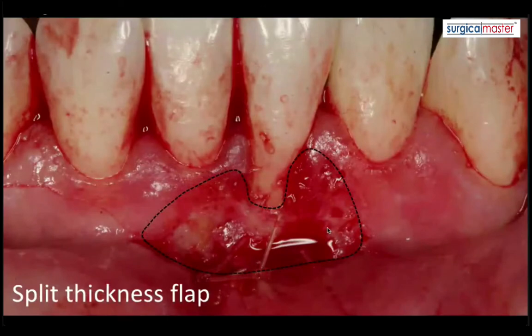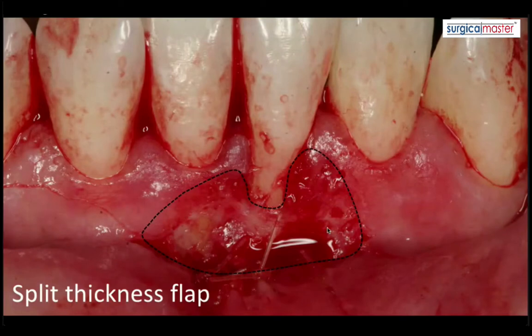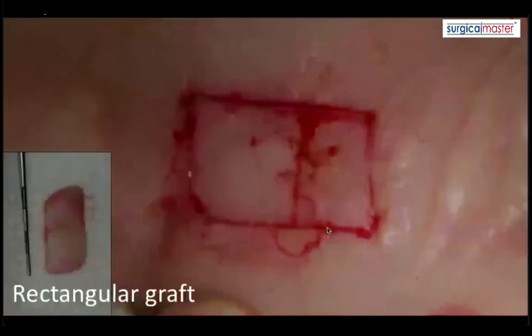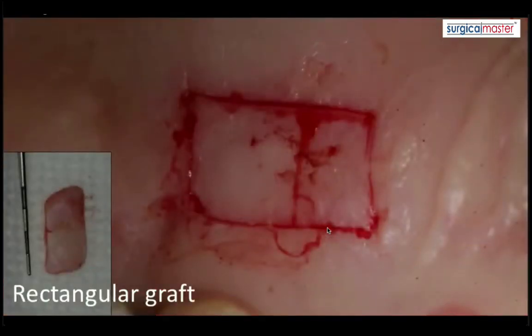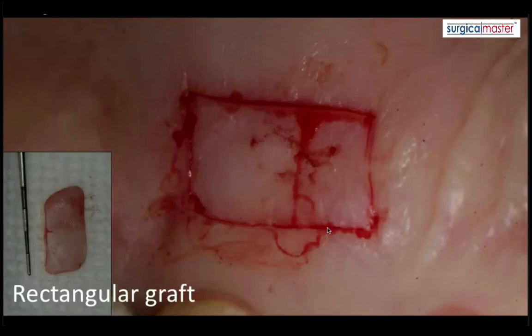By suturing apically, you expose the underlying connective tissue, which has really good vascularity. You de-epithelialize whatever existing attached tissue there is, then harvest a free gingival graft from the patient's palate. The best place to harvest is from the flat part of the palate — not from the rugae — and staying away from the soft palate. Typically a rectangular shape.